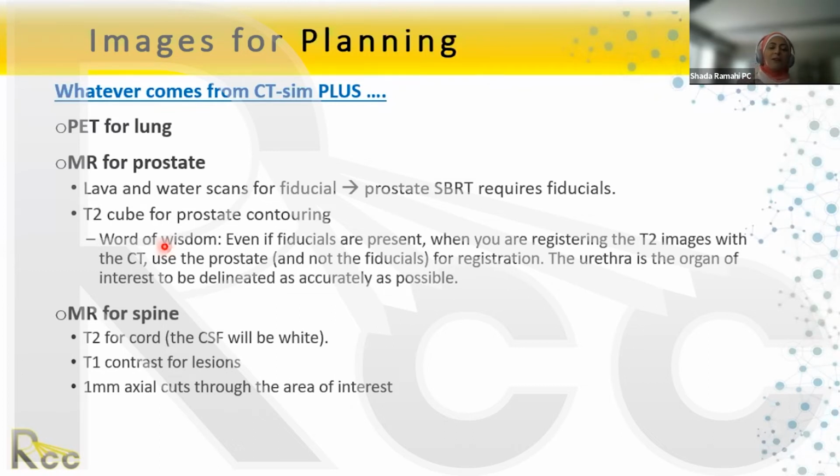So when we're doing registration between T2 and the CT for prostate, we actually have to do the prostate to prostate registration, and that is extremely difficult. You could barely see a prostate gland on the CT sim. At least to me, it's difficult. So what we end up doing is that if I'm taking a case, I'm doing this prostate to prostate registration, and then I always send a note to the physician, please review and fine-tune the registration as you see fit.